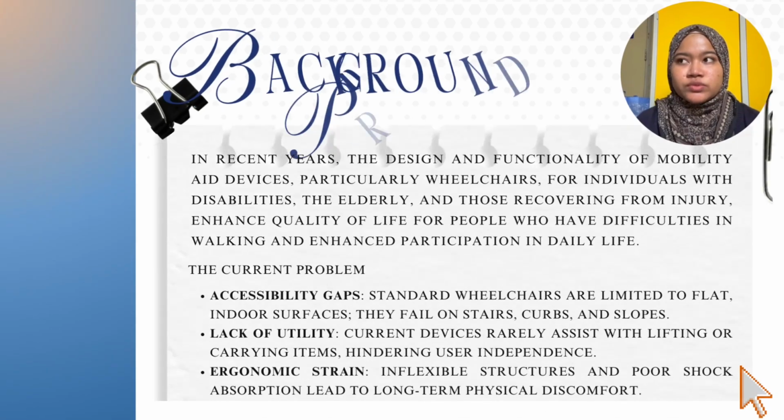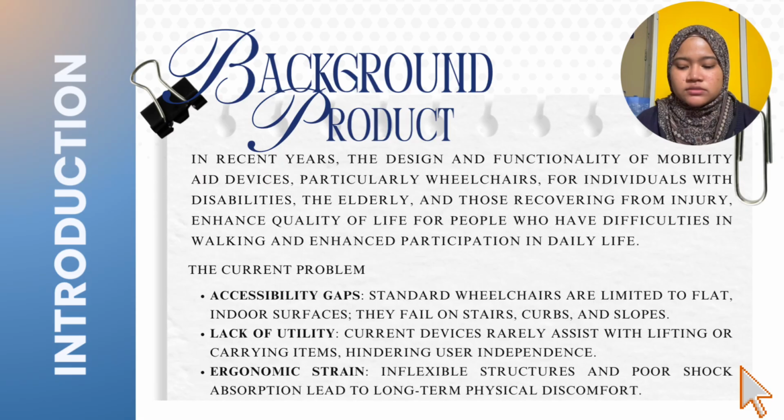For the introduction, in recent years, mobility aids such as wheelchairs have become increasingly important in improving the quality of life for people with disabilities, the elderly, and individuals recovering from injuries. These devices are no longer used only for transportation, but also help to promote independence, comfort, and participation in daily activities.